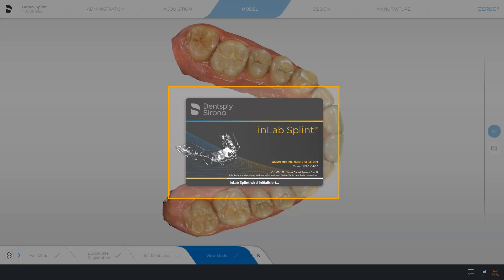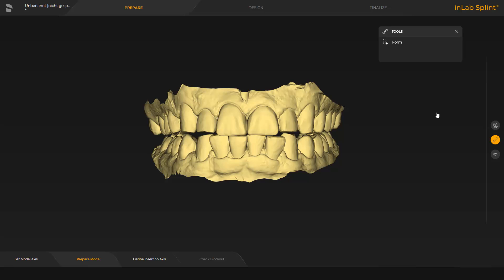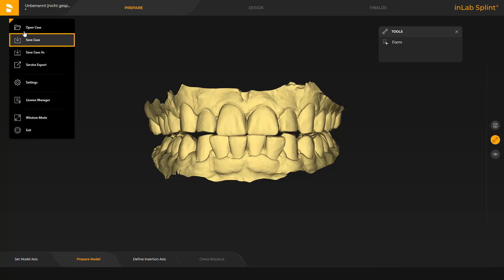The corresponding app opens automatically, and the case is already open. First, we tap the Dentsply Sirona icon in the upper left corner and save the case.